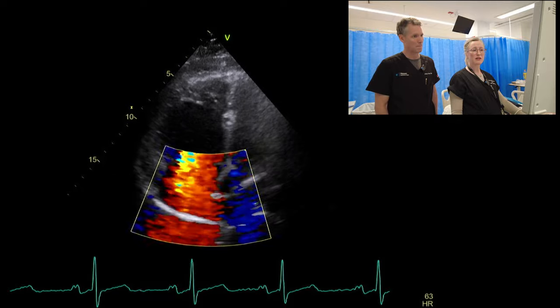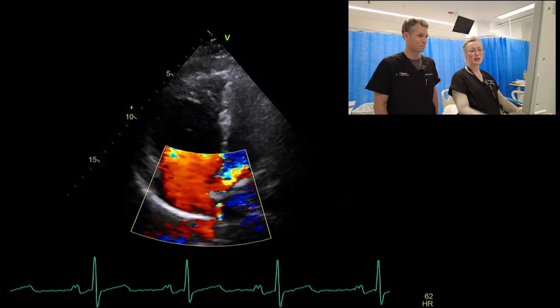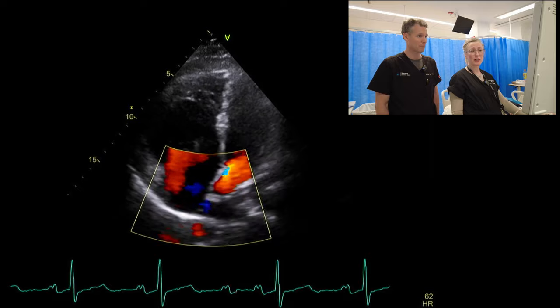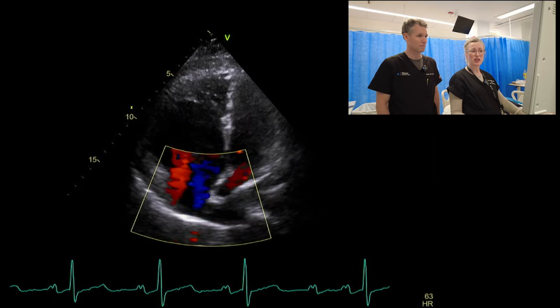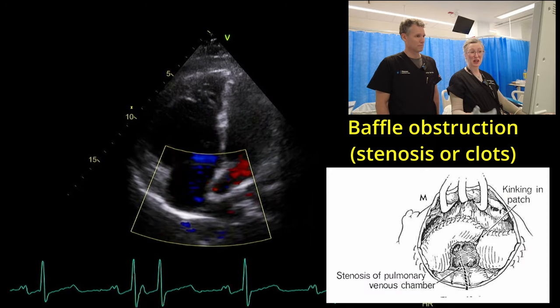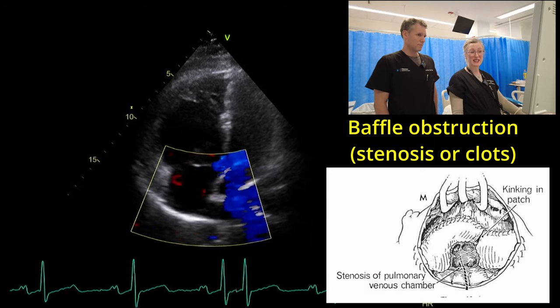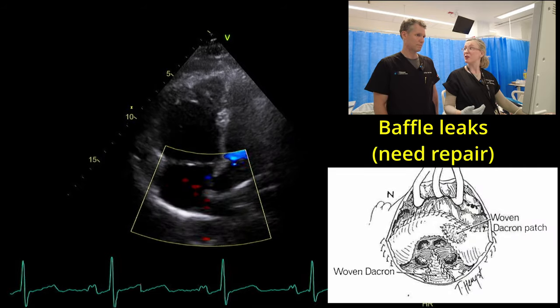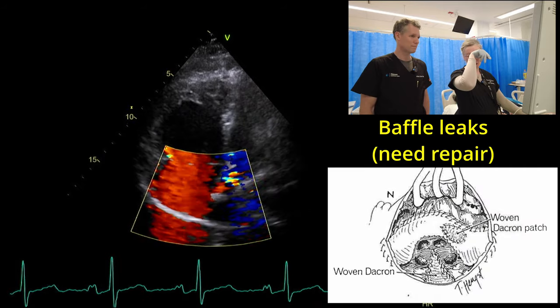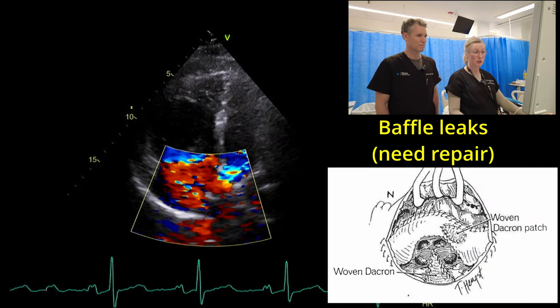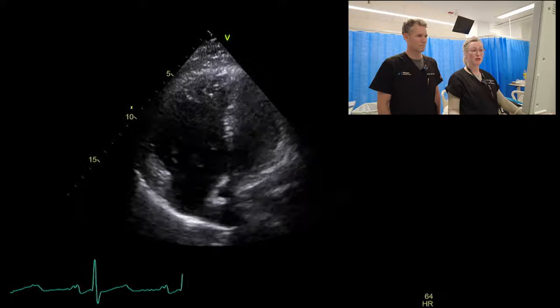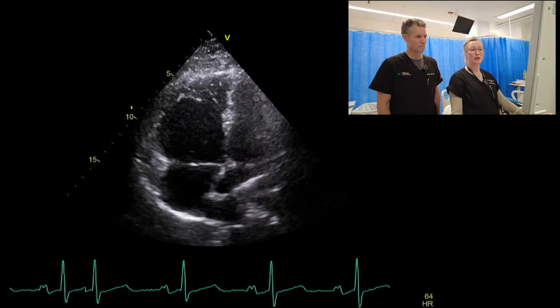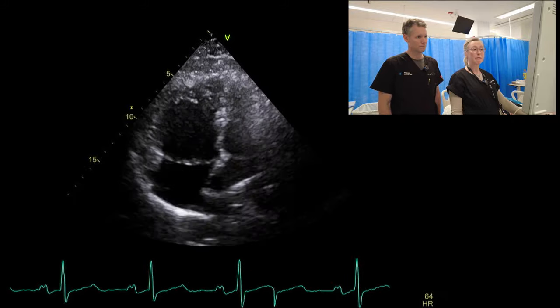You're not getting the best focus as it's perpendicular, but you want to absolutely look for evidence of obstruction — with 2D looking for clots and thrombus. But also leaks — baffles can also leak. That's really important to look for as well as obstruction. So baffle leaks and obstructions are definitely something you want to be interrogating for.